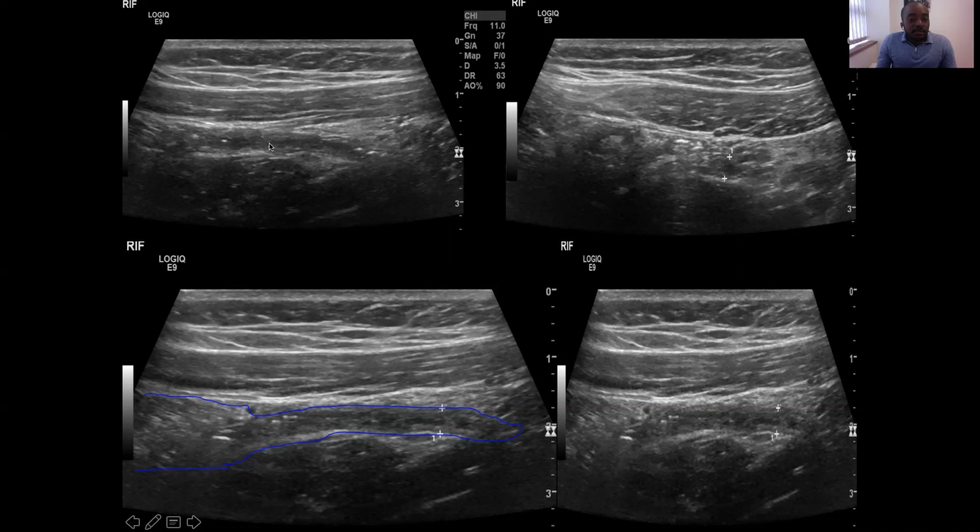It's a bit subtle, but when normal, it can be that subtle and that tricky to see. Some literature says about 50% of normal appendixes are not visualized on ultrasound. In many cases, it can be tricky to see a normal appendix, but it doesn't mean we shouldn't try, because when we confidently visualize the appendix, then we can say, yes, this patient does not have appendicitis, and the doctor can focus on trying to find what the actual cause of the patient's concern is.